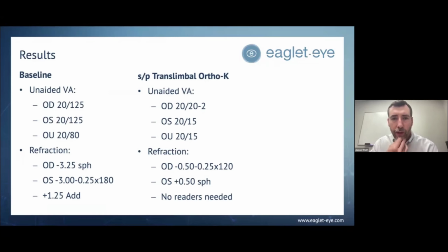When we look over here at the results, ultimately unaided before was not very good, very typical of a -3. And then when we look at the post results, being in monovision, kind of a mild, intermediate monovision, you can see that the right eye is somewhere around maybe a -0.5 diopters, and maybe with a little regression up to about -1 diopters throughout the day.